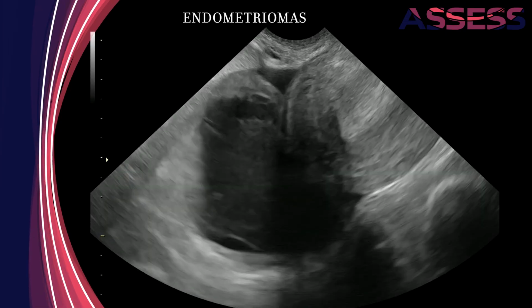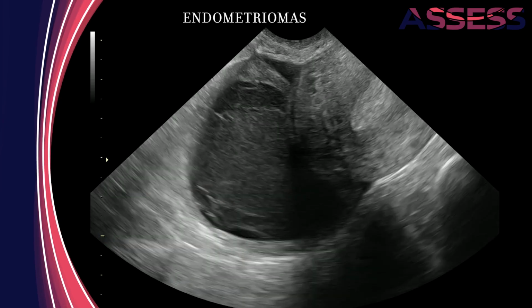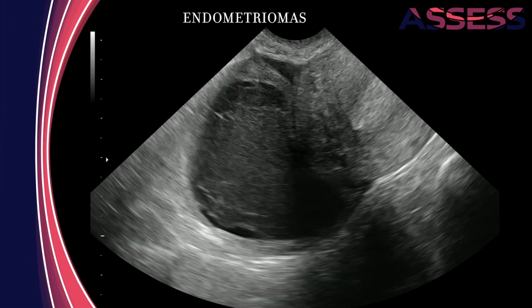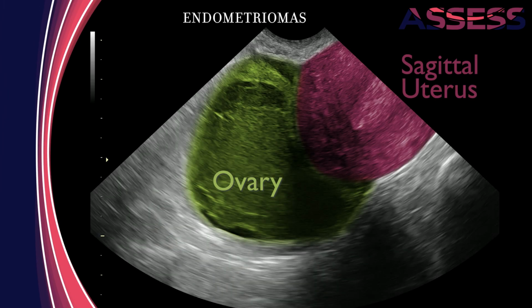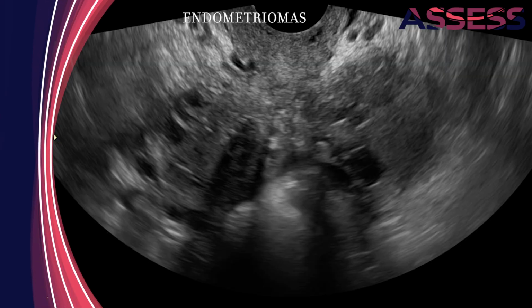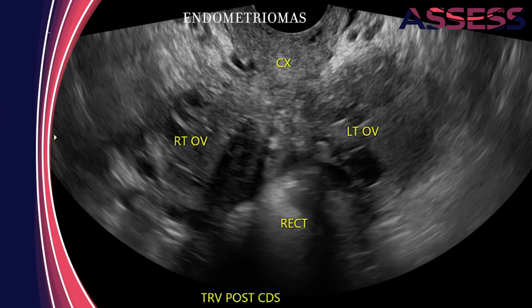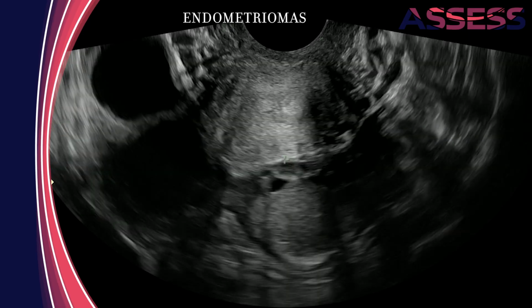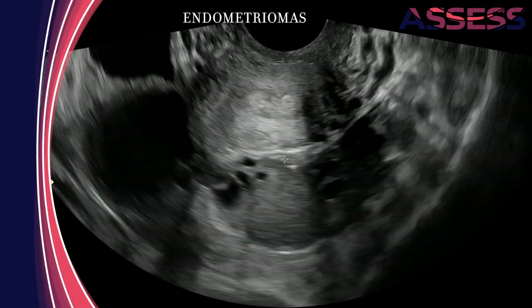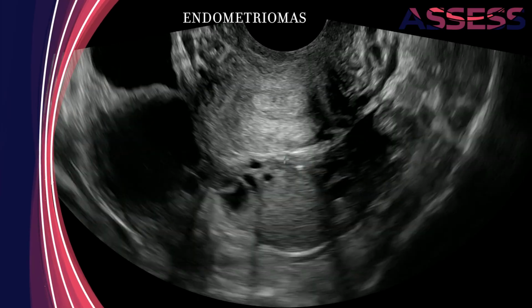If the ovaries are tethered by adhesions or nodules of endometriosis, they may be difficult to see or they may be located in an unusual position, such as superior or posterior to the uterine fundus. They may also be located lower than usual if they are tethered to other pelvic structures, such as the rectum or uterosacral ligaments. Often associated with endometriosis is the kissing ovaries sign, which is suggestive of severe pelvic adhesions.